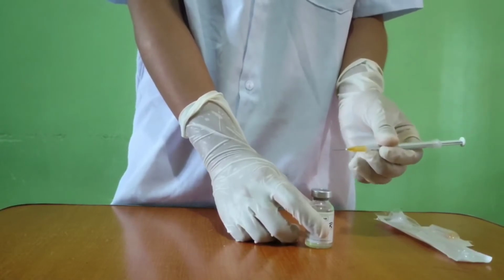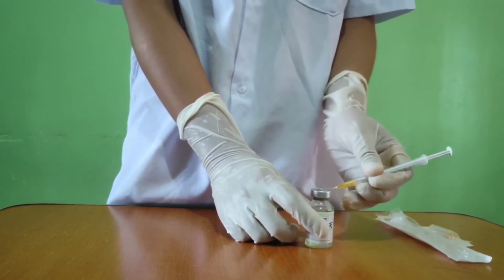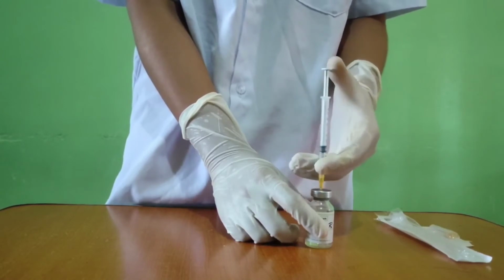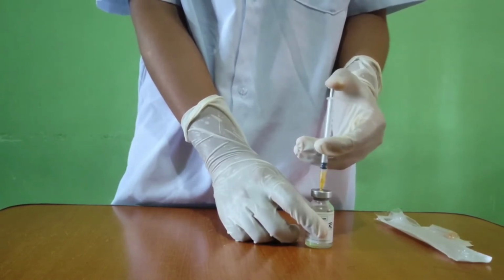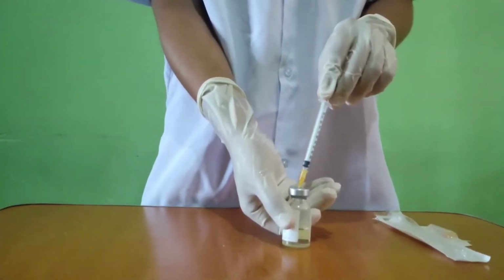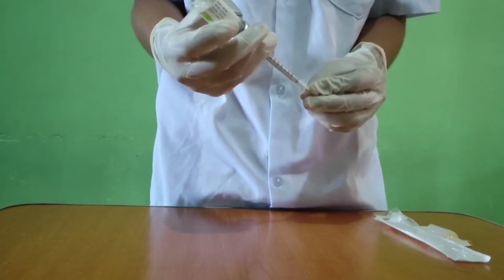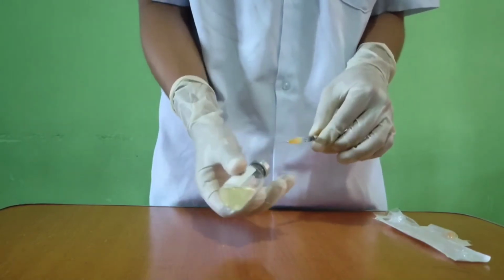Here, we're going to insert the syringe into the vial with the bevel up, and gently insert it through the stopper of the vial. Push the air inside the vial. Then we flip it upside down and pull back to 0.3 cc. Then gently remove it.